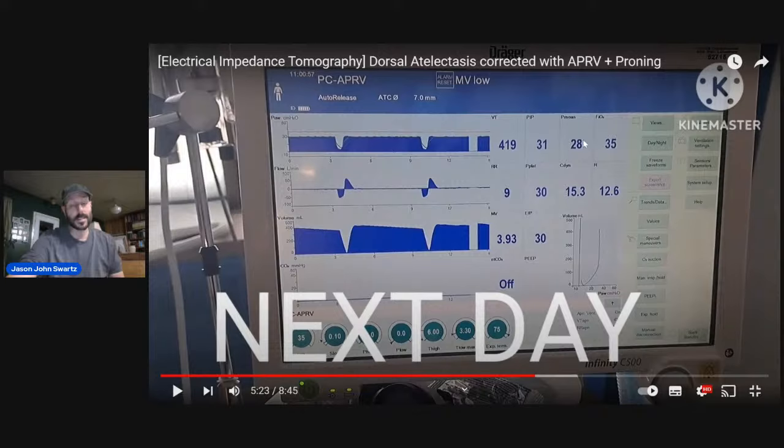And that's the thing, because there are some doctors that don't care. They don't want APRV. They don't like APRV. So sometimes they'll switch it, and even if you have a PEEP of 18 or something, you're not going to be able to attain this high mean pressure in conventional modes, in my opinion. How high do the parameters have to be to have a mean pressure of 28?